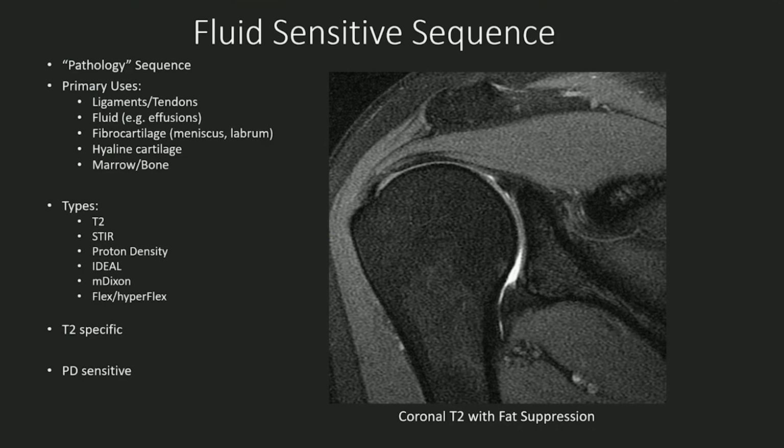Awesome. I think a lot of our folks look for disc herniations, rotator cuff tears, labral tears and such. So that's very helpful to understand how to look at it. How would you know that maybe there's a tear?